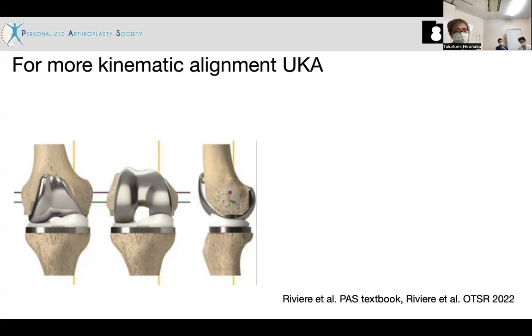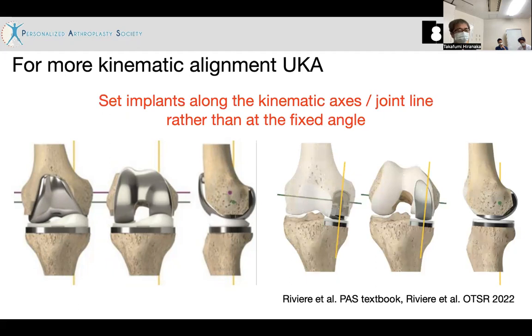Anyway, it is not perfectly possible so far. So it requires a kinematic specific component or patient specific component. Okay. So let's move on to talk about kinematic UKA.